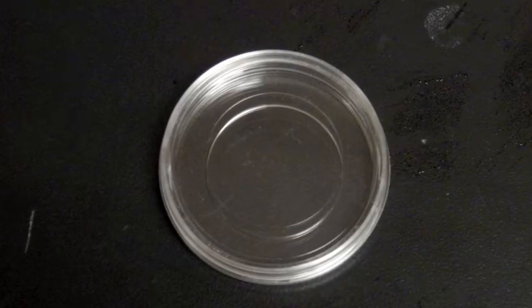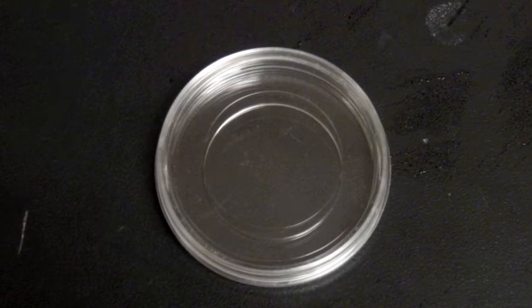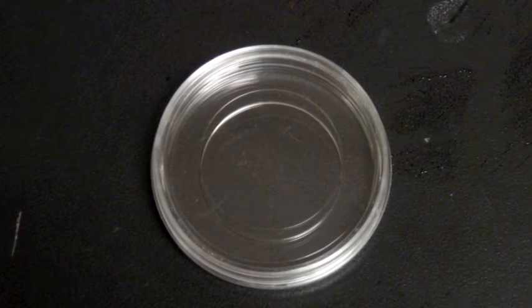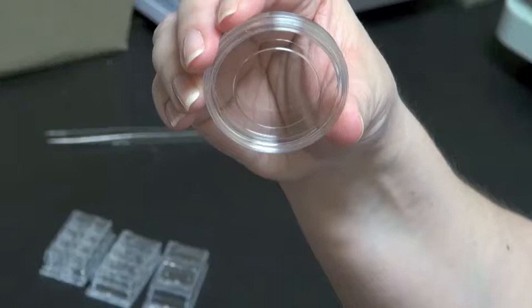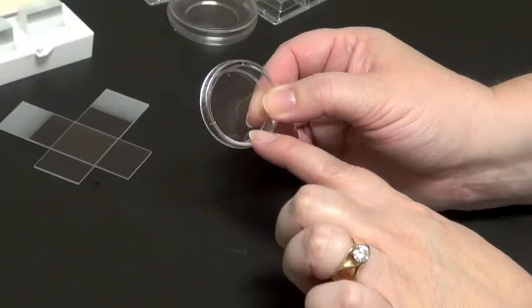Also available are mat tech or chambered petri dishes. These have, you'll notice, an inset of a cover glass bottom so we can grow the cells right on top of the cover glass and then image directly through.